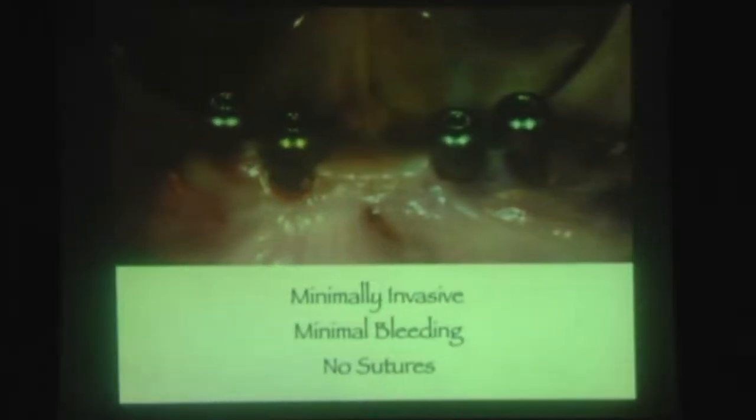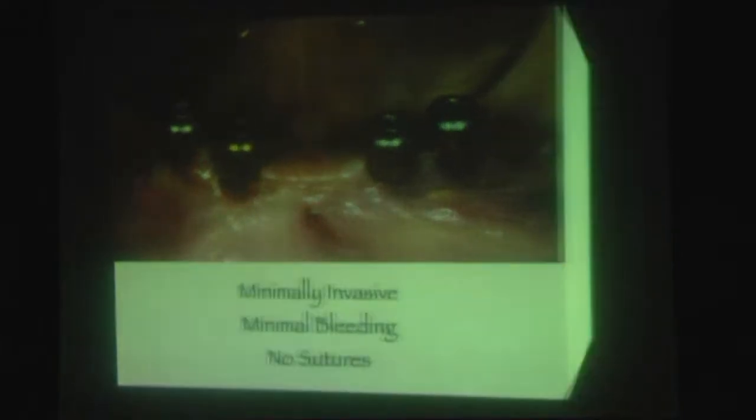Okay. So we finished the surgery. This is minimally invasive, no bleeding, no stitches, no cut, no incision, okay? No edema, no pain. The patient is always looking for this. But later, let's evaluate this with the keratinized tissue. Maybe we can improve the keratinized tissue quality and quantity. But it's not the issue now.